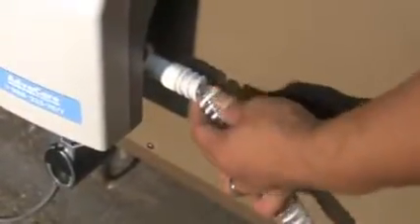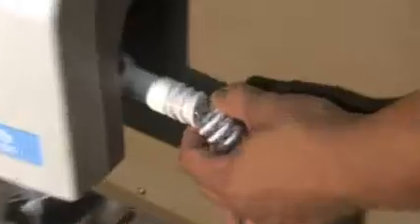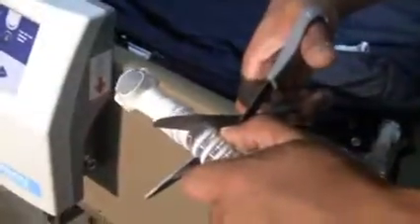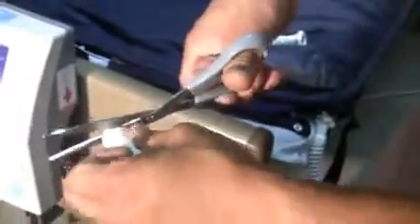If your tube set does have a hole in it from the hot air of the air unit overheating, you may power off your air control unit and disconnect your air tube from your air control unit. You may get some scissors and cut the air tube connection at the hole at that point. The next thing you would want to do is slightly unravel the rest of the tube connection that's around your tube connector.